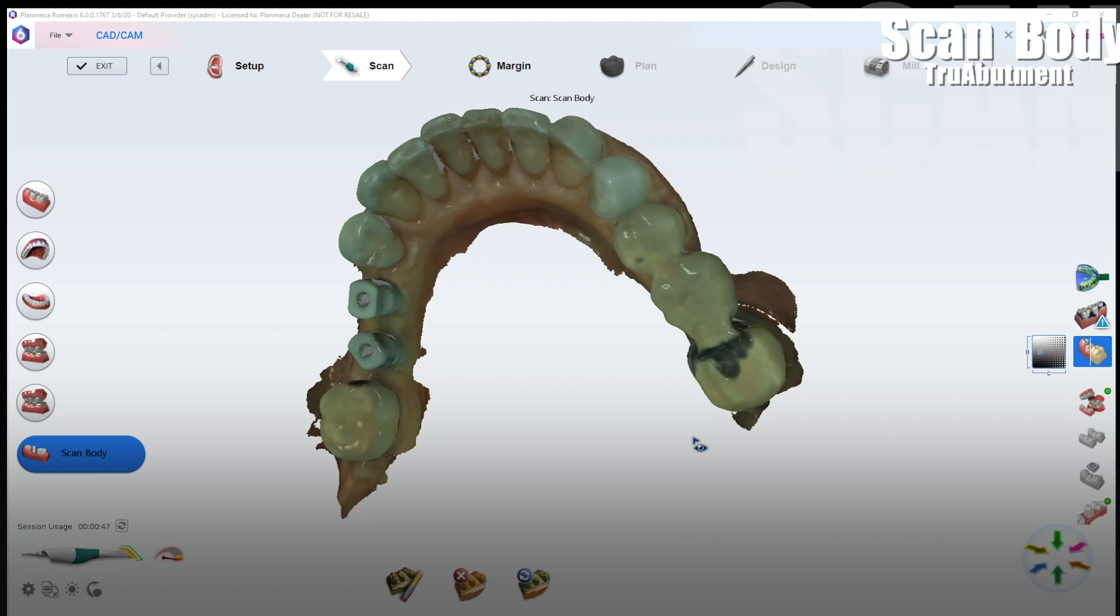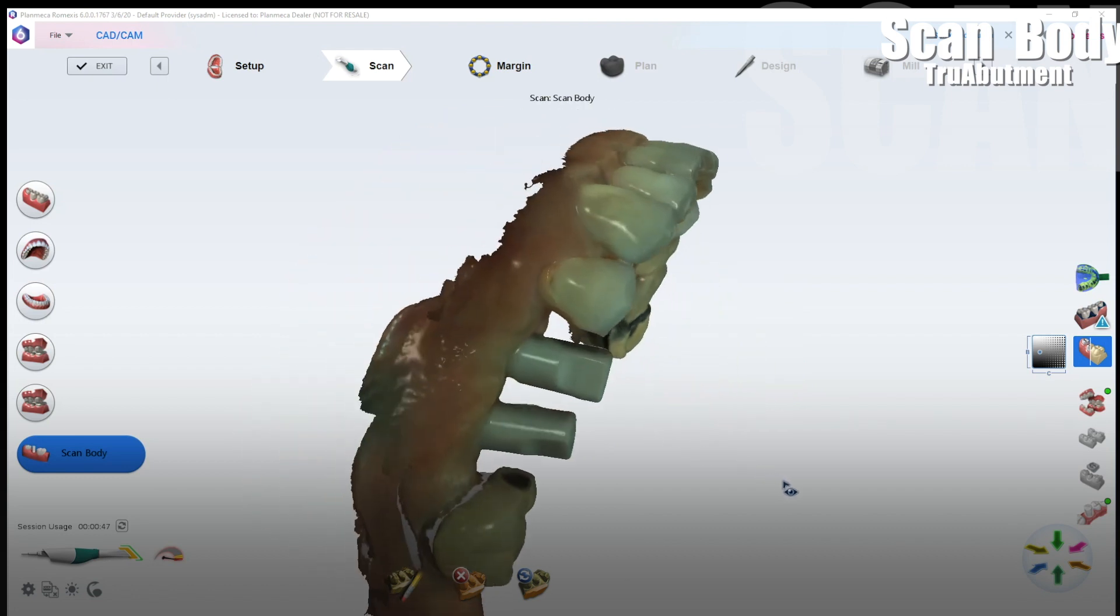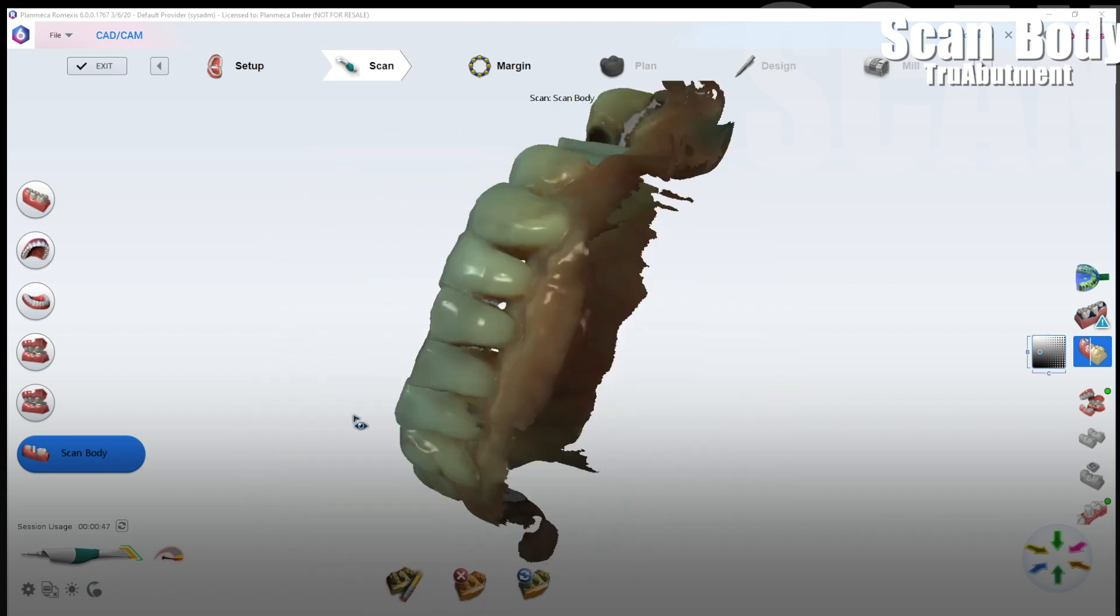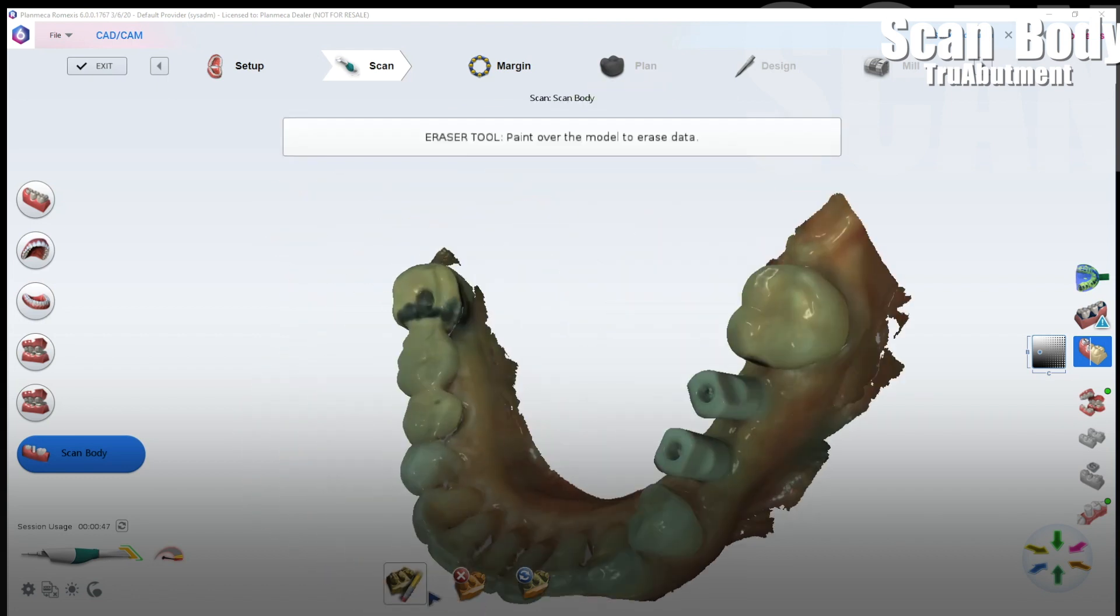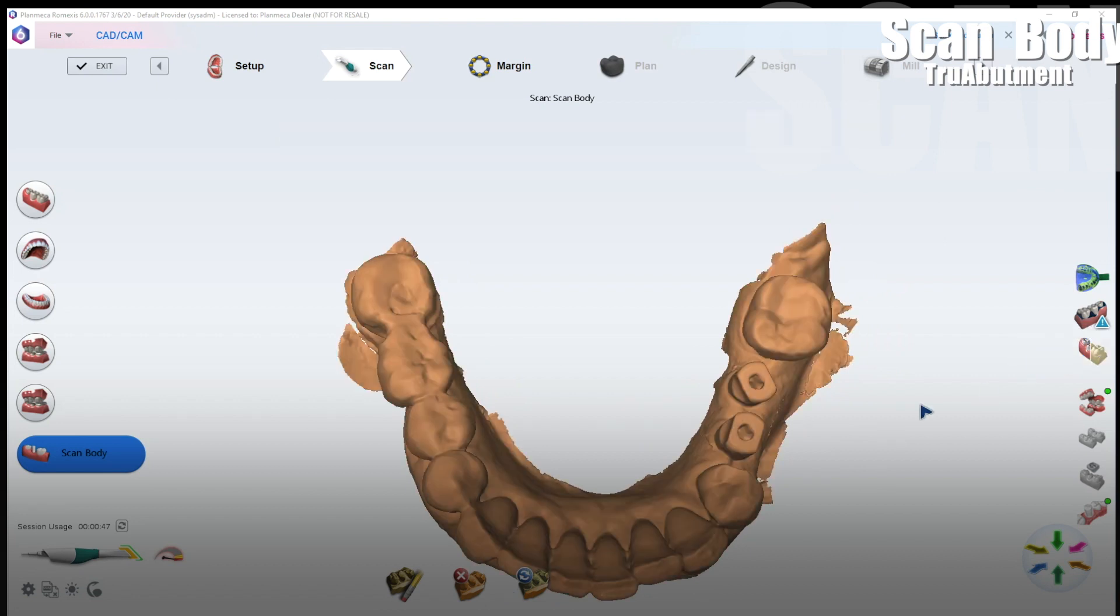What you have to realize is that labs such as True Abutment are going to use 3Shape or ExoCAD to virtually pin a STL file of that exact scan body to this model to determine the location of the implant in the bone. To do that they need adequate data to be able to merge those. The most important data points are those flat surfaces on the occlusal view here.